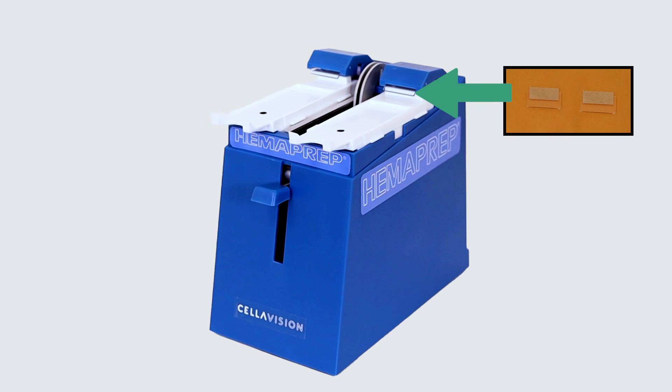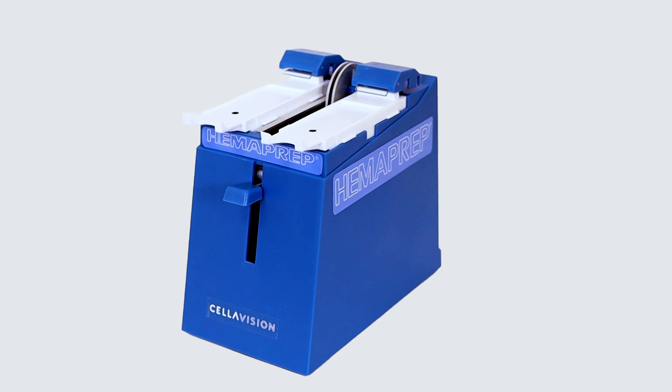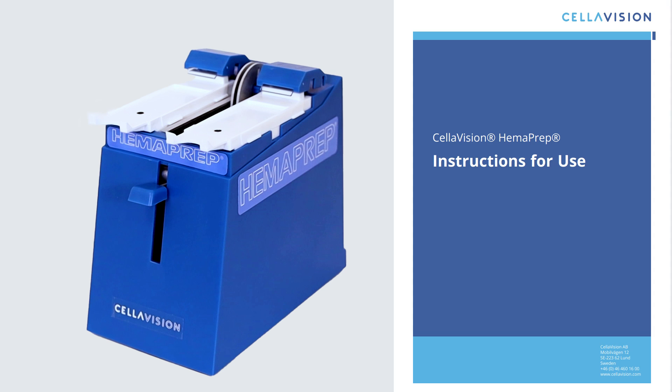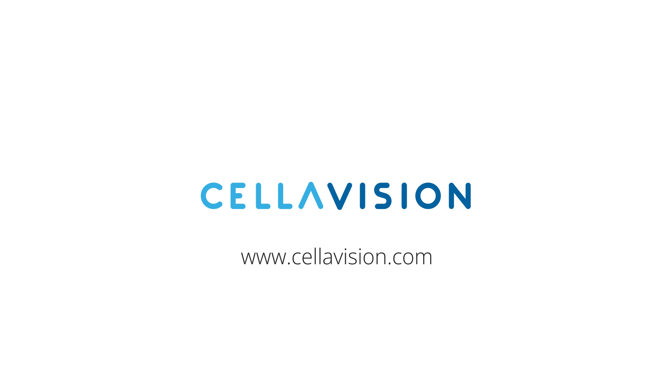When needed, you can replace the spreader blades. Signs that the spreader blades are starting to wear are crooked smears or streaks in the smears. Check the instructions for use on how to do this correctly. You can find more information in the instructions for use.